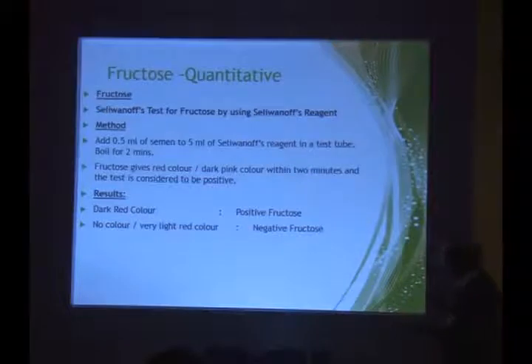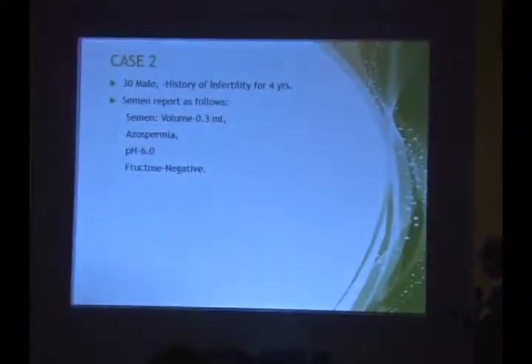This we have discussed, so I need not repeat it. This is the method for those of you who want to note down, that I have already outlined. You take 0.5 ml of semen, 5 ml of the reagent.